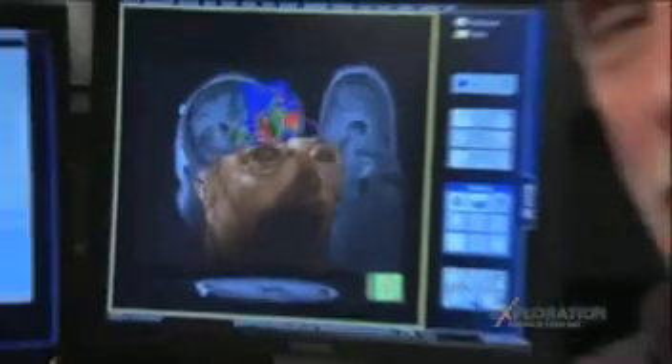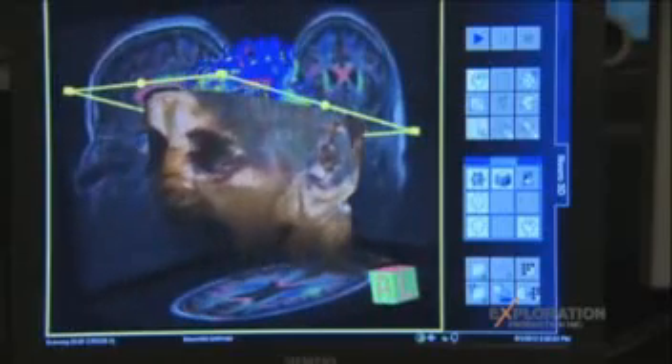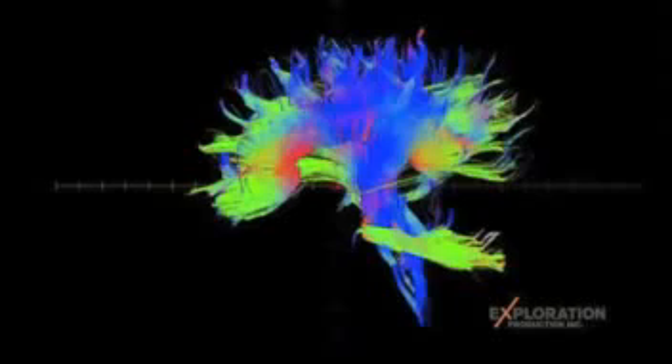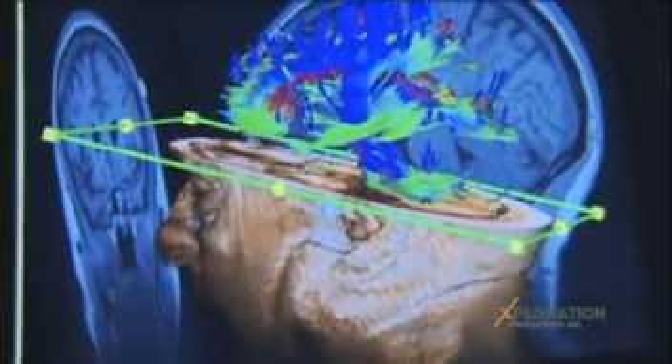My obsession to map my body from the inside out now goes even deeper — right to the core of my brain. This is a diffusion tensor imaging scan, and basically what it allows us to do is look at the white matter in the brain. Think of the white matter as the wires that connect the different parts of the brain and allow them to communicate. Diffusion tensor imaging is an MR-based technique that allows neurologists to get a good look at those fibers and spot abnormalities that could hint at diseases like schizophrenia or multiple sclerosis. The colors indicate which directions the fibers are pointing.